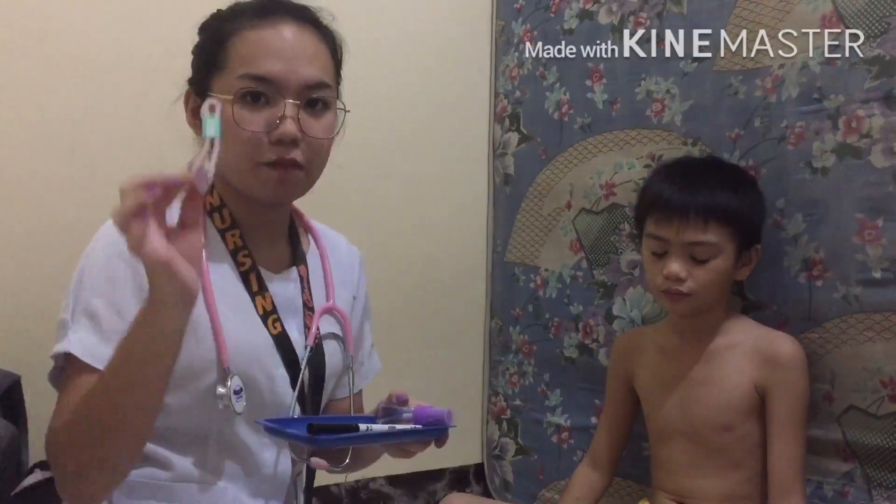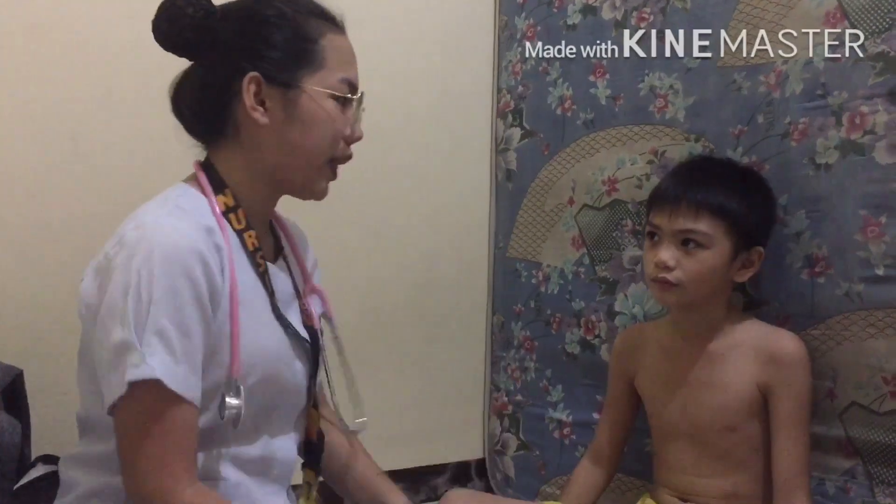Hi, good morning. I am Yana Isabel Gadi from BSN13 and I am going to perform the assessment of the abdomen. Next, let's prepare the equipment we will use for this assessment. First is the stethoscope, and then the alcohol for hand hygiene, the marker, and then of course the tape measure.